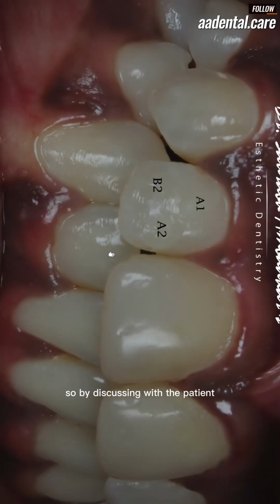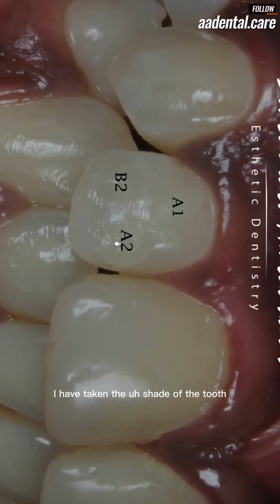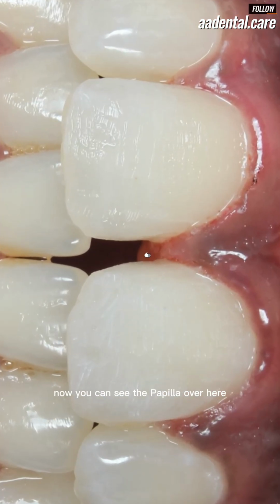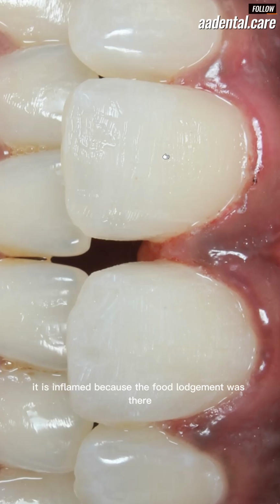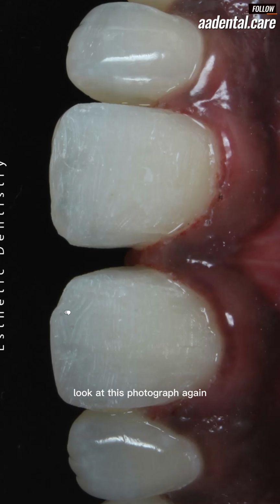So by discussing with the patient, I decided to go for direct composite veneers after removing all the old composite. Here with the button technique, I have taken the shade of the tooth. This is the photograph after removal of all the composite. Now you can see the papilla over here, it is inflamed because the food lodgement was there. I have kept some of the composite layer over here because I did not want to hurt the enamel of the patient.